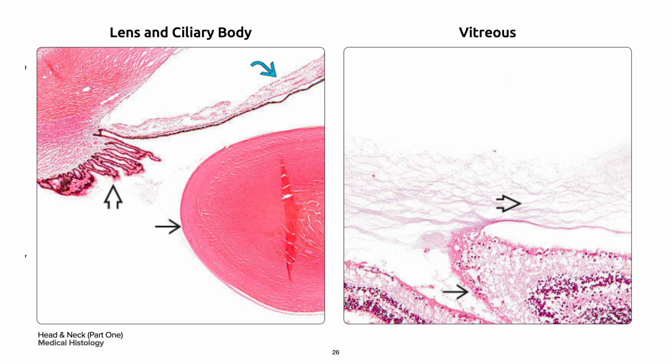On your right is nearly acellular transparent vitreous in bold black arrow, which fills the area posterior to the lens, extending circumferentially to the multi-layered retinal epithelium. This is in the black single arrow. The vitreous is a gel-like substance principally composed of water and hyaluronic acid.